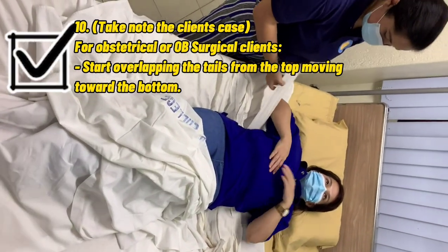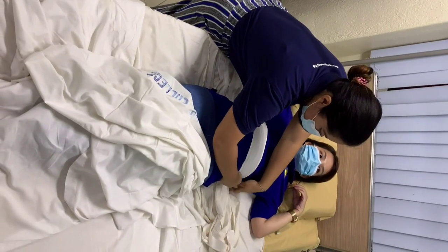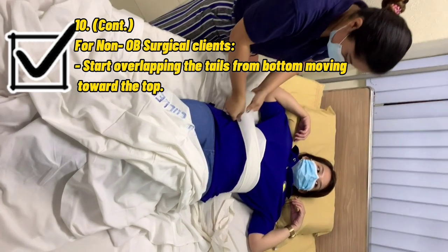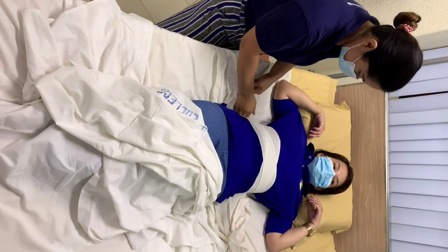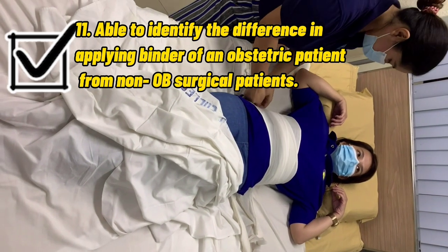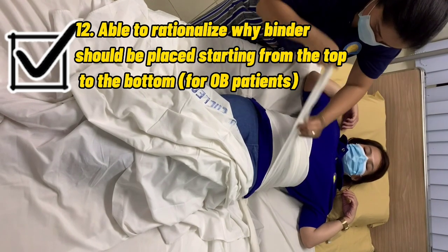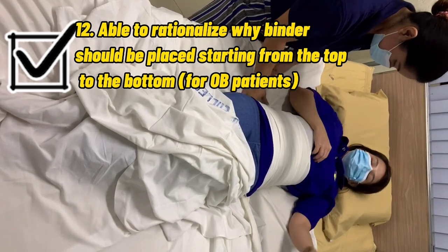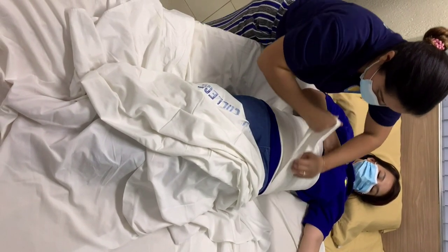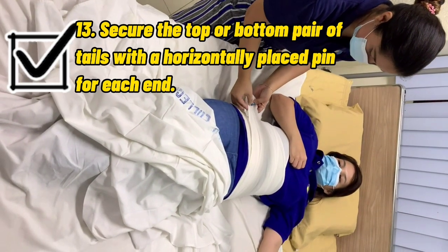Start overlapping the tails from the top, moving toward the bottom. Secure the bottom pair of tails with a horizontally placed pin for each.